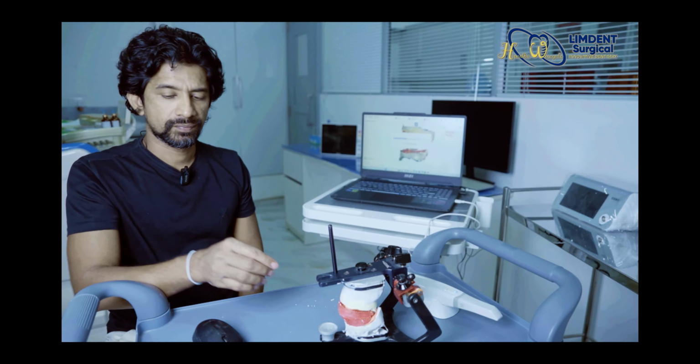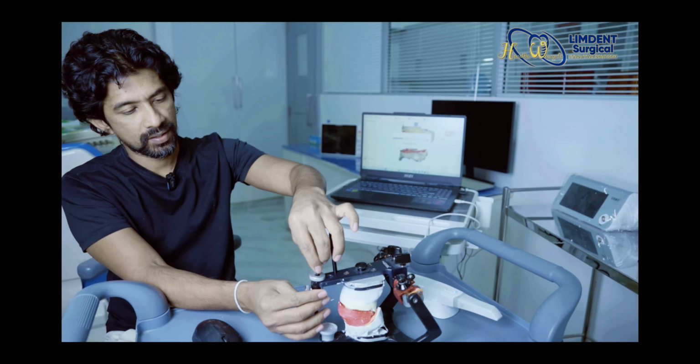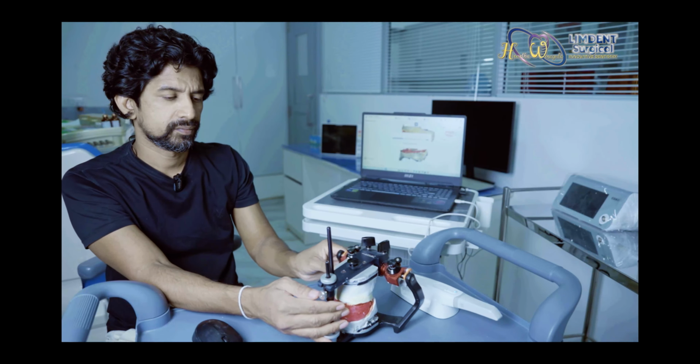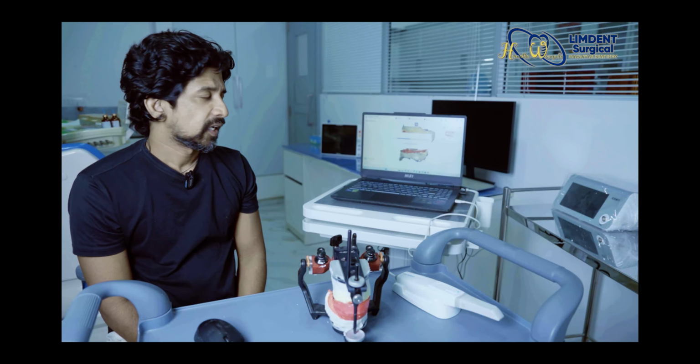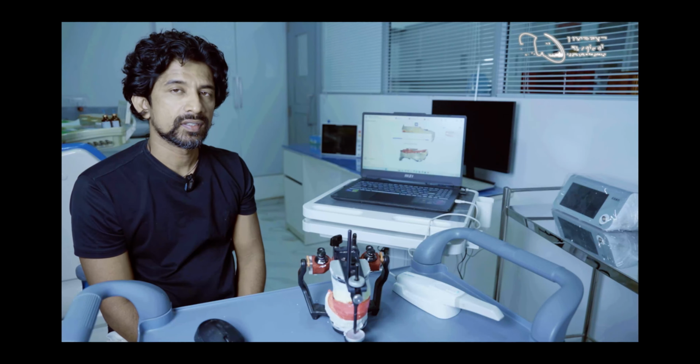There you go. You can mount the incisal rod to the articulator and secure it for your future need. And you see how the data has been processed after you scanned and collected it from the articulator and the bite blocks directly with the intraoral scanner.